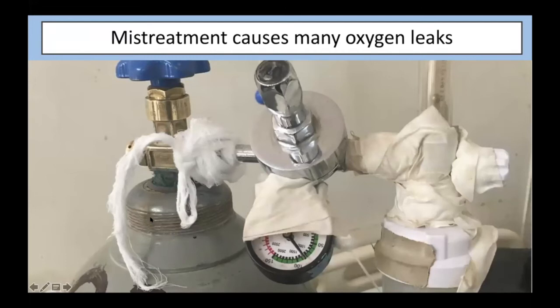This is an example of a device that has been mistreated. It wasn't properly installed. Over time, you can see now that clinicians, nurses, aides have done many things to try to save or redeem this piece of equipment because it's leaking where it connects to the cylinder, it's leaking at the gauge, it's leaking at the regulator, it's leaking at the flow meter. Why? Because it wasn't handled properly. Because someone did not use great care when installing it to the cylinder, and all of these functions now are not working, and so we're now using surgical tape to try to prevent leaks. It doesn't really work.